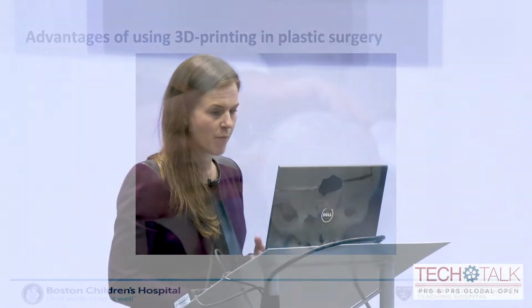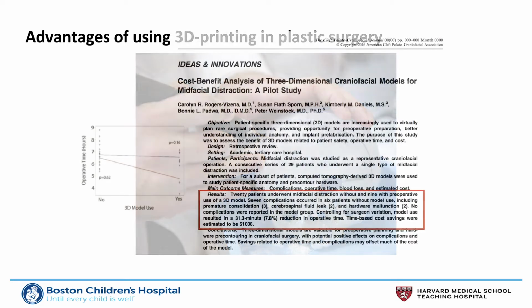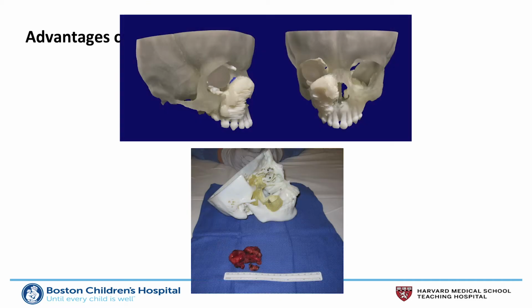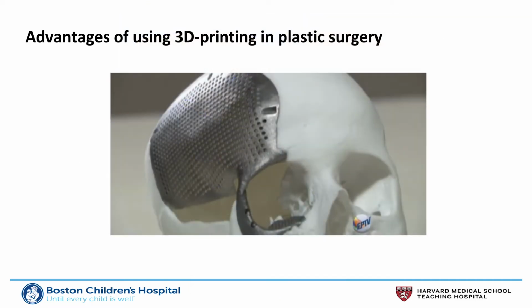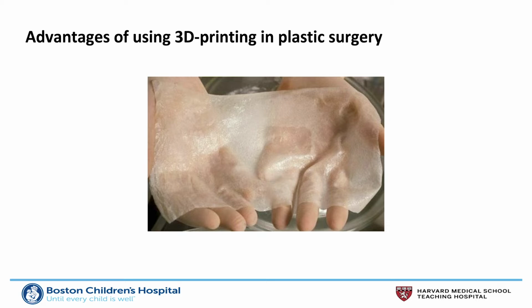So that wealth of publications has really underscored the advantages of using 3D printing in plastic surgery, and those range from things like opportunities to teach and practice procedures prior to going to the operating room, increased operative speed and decreased complications, which all come together to decreasing cost, better understanding of patient-specific pathology and anatomy, customized facial implants and facial prostheses, and this whole new wave of bioprinting. So now people are 3D printing lots of materials that can be used as implants and scaffolds, and I think that's really going to usher in this whole new wave of reconstructive opportunities for you guys as plastic surgeons.